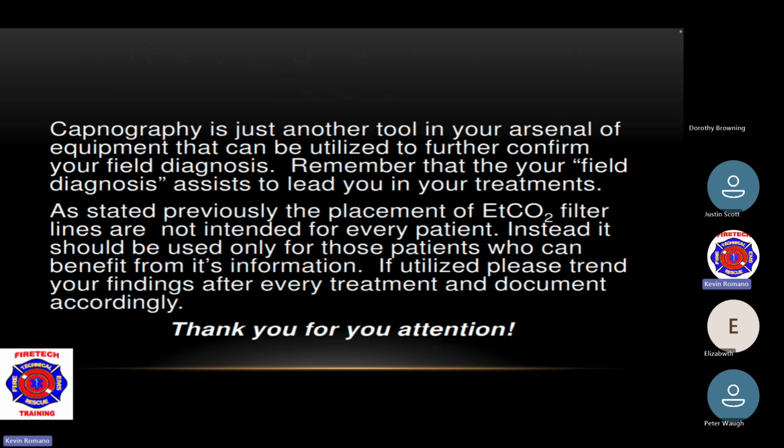Remember that capnography is just another tool in your arsenal of equipment that can be utilized to further confirm your field diagnosis. Remember that your field diagnosis assists to lead you in your treatments. Also stated previously in placement of end-tidal, filter lines are not intended for every patient. Instead, it should only be used for those patients who can benefit from its information. If utilized, please trend your findings after every treatment and document accordingly.